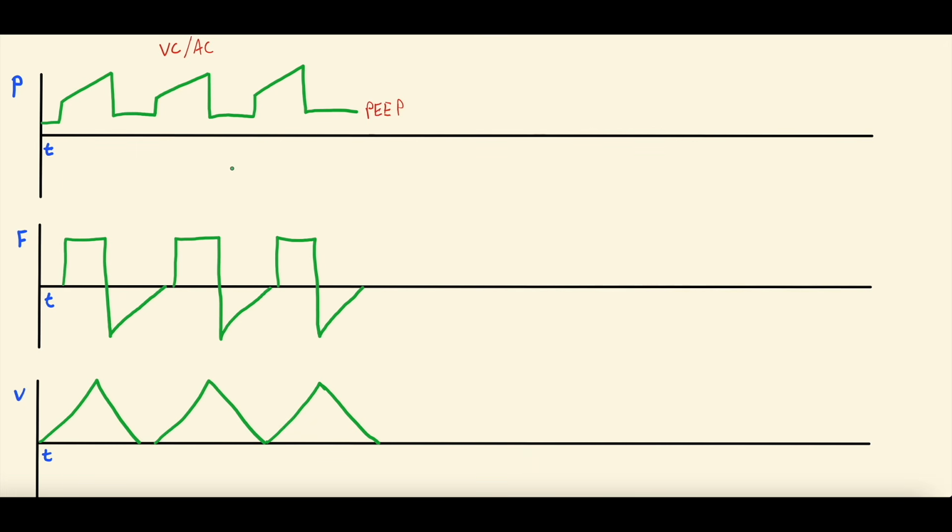Because that is how you diagnose flow starvation, is by looking particularly at the pressure scalar. So what happens in flow starvation to the pressure scalar is you have your normal, this is just PEEP, there's no breath. The patient has a slight negative dip in their pressure scalar, meaning they're initiating a breath, right?